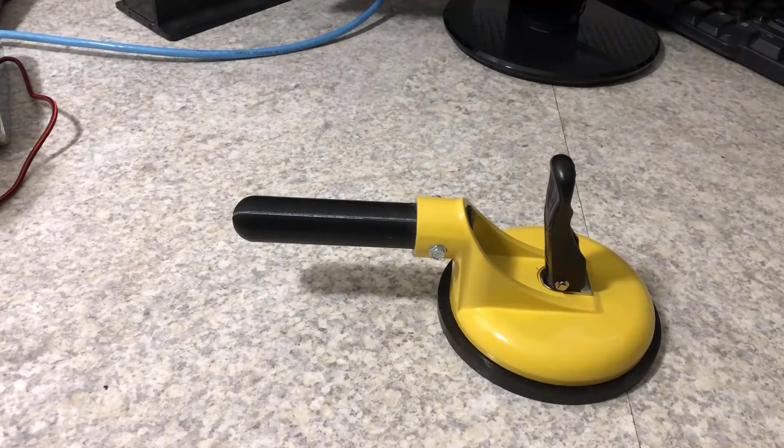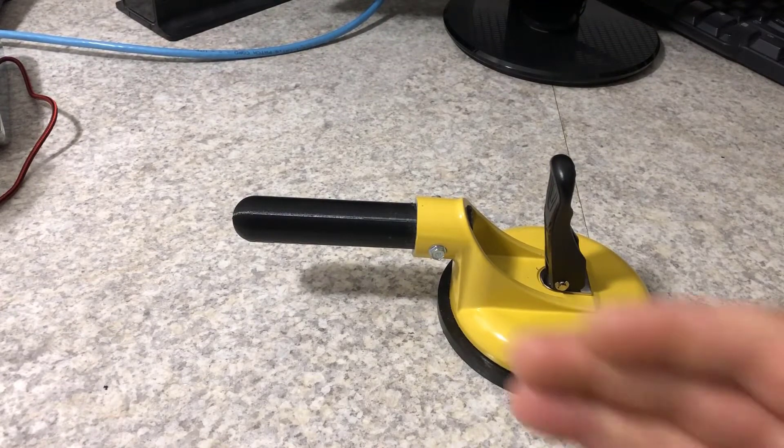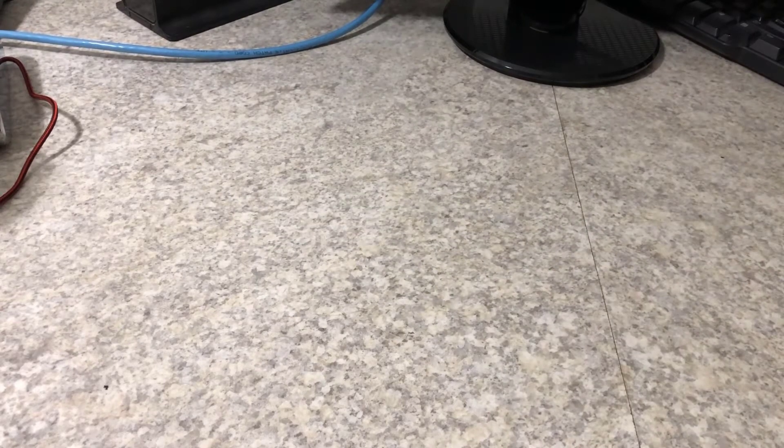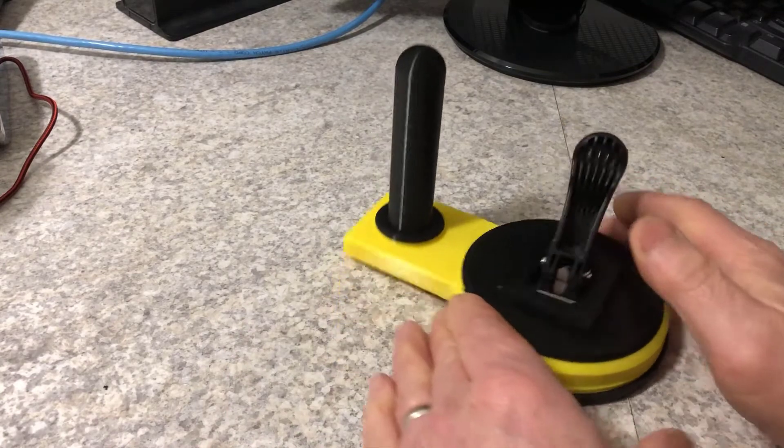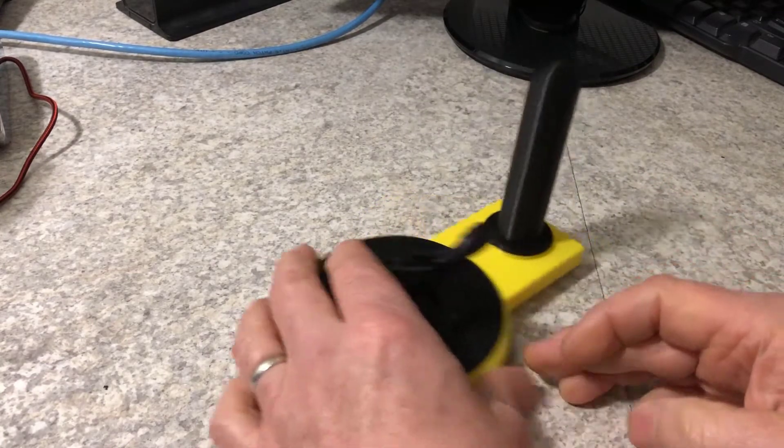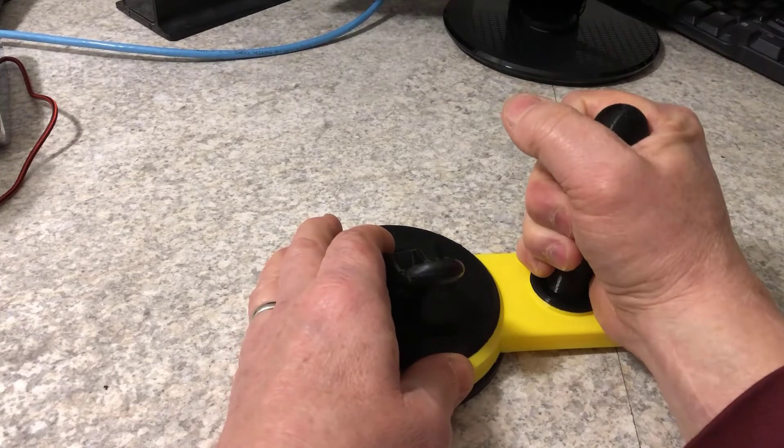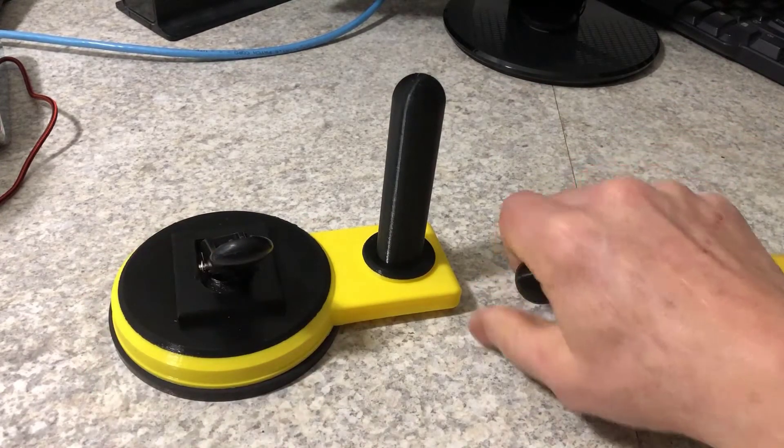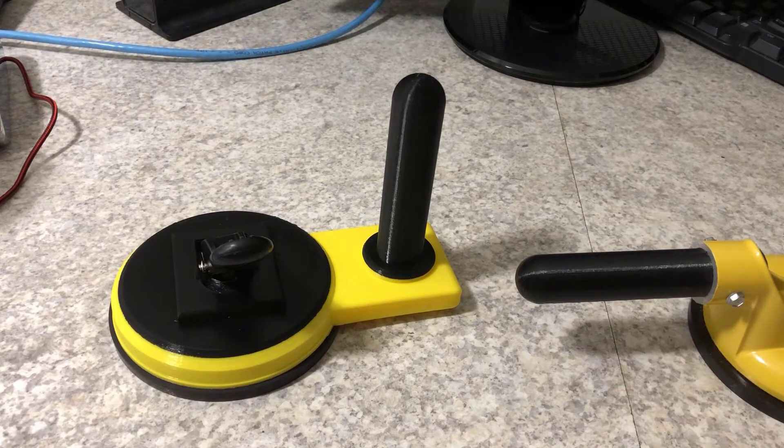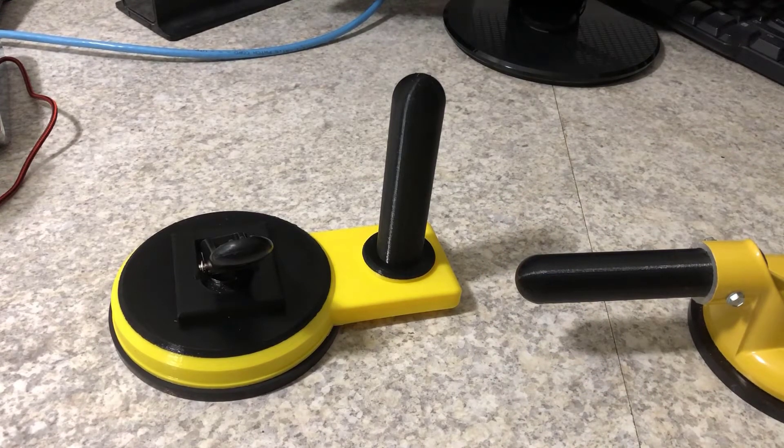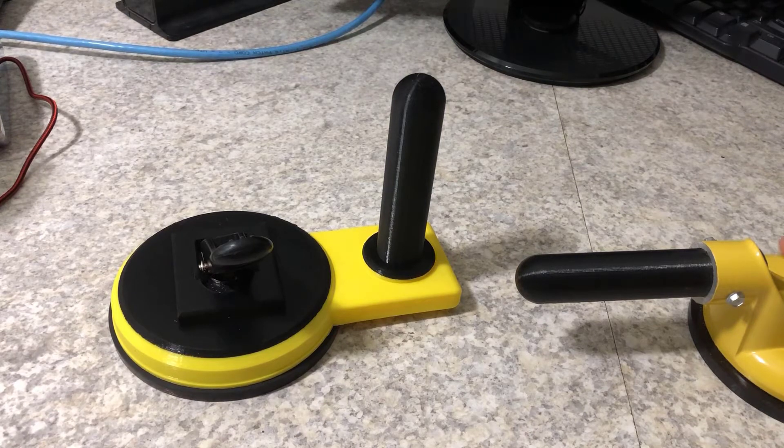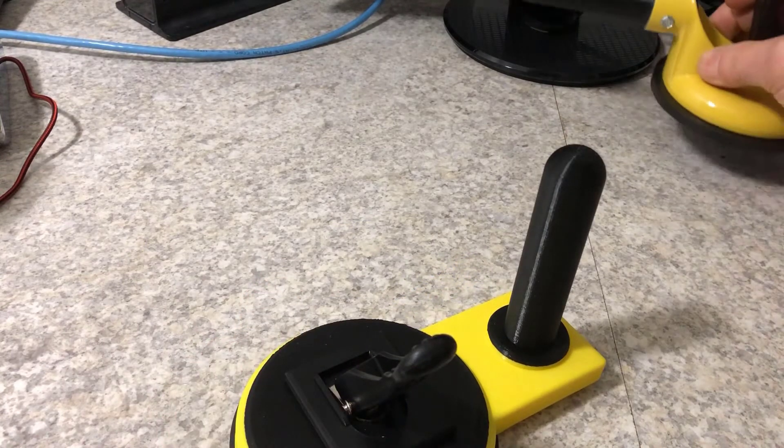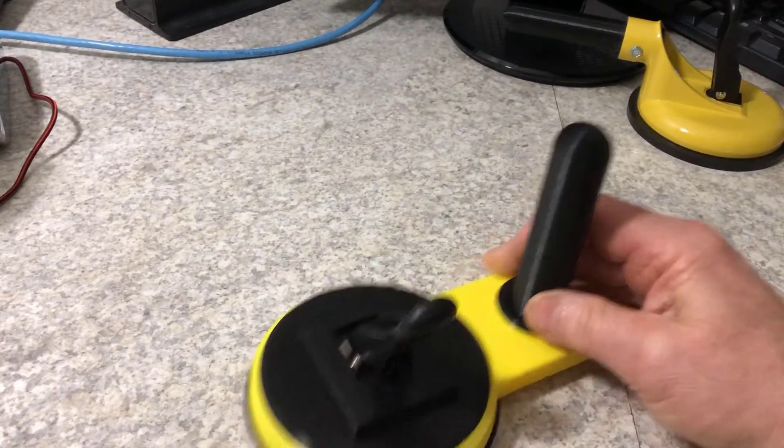In this video, we're going to look at an alternative to our horizontal grip, a vertical grip. Sometimes students find it easier to grip in this position as opposed to this position. Your physical therapist or occupational therapist probably would be the best bet if you're unsure, but having both makes great sense. This is the second part of this presentation.